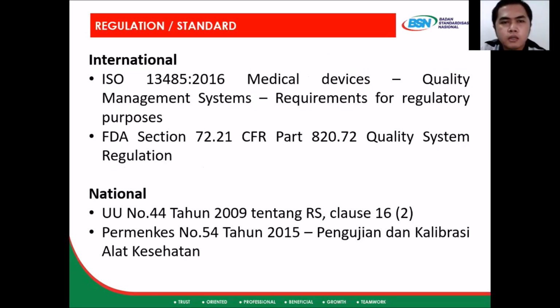Well, there are already regulations, national or international, which state that medical devices should be tested or calibrated. Internationally, there are ISO 13485:2016, medical devices quality management system, requirements for regulatory purposes, and FDA section 7221 CFR.